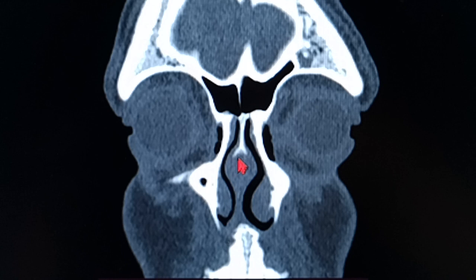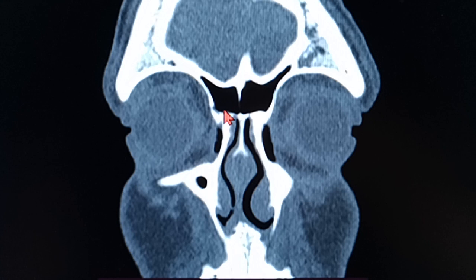So floor is still intact. That is basically still the frontal sinus. Nothing extra on this plane. Going behind, you can still see it is pretty much intact. I would still call this as frontal sinus. This patient has a huge sinus basically. Going behind again, you can still see it is intact, still intact.